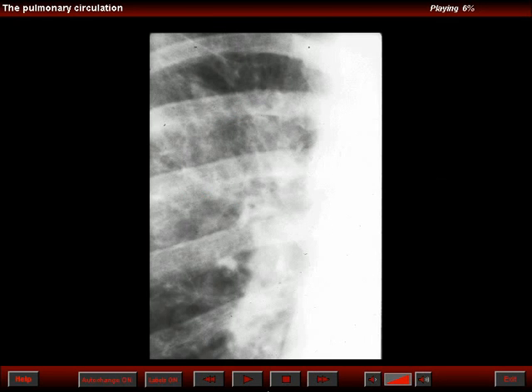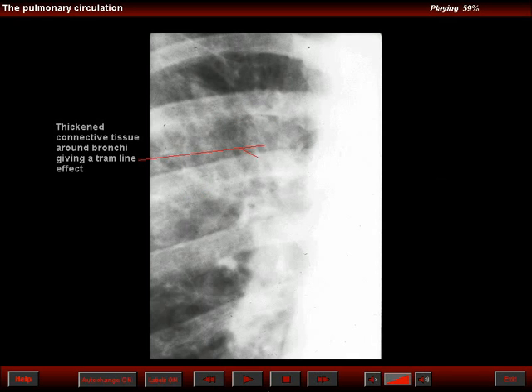When the walls of the bronchi appear thickened and this is the result of connective tissue thickening around them, a tram line effect appears, as noted in this patient, again courtesy of Dr. Heitzman.